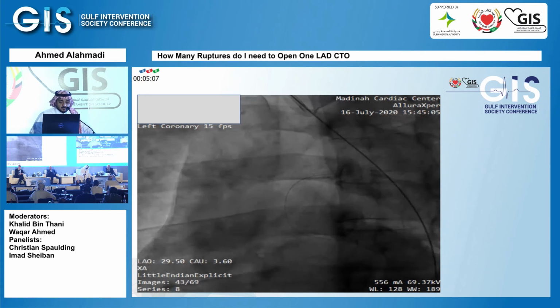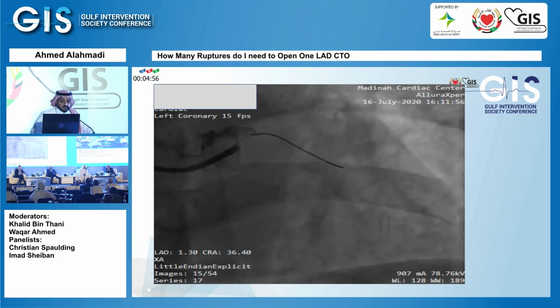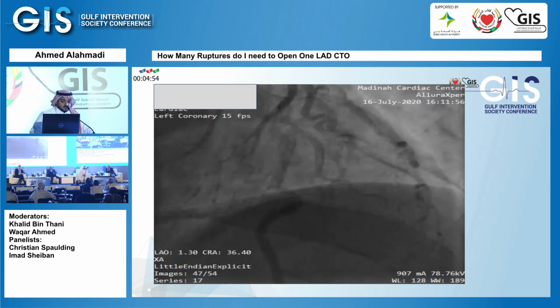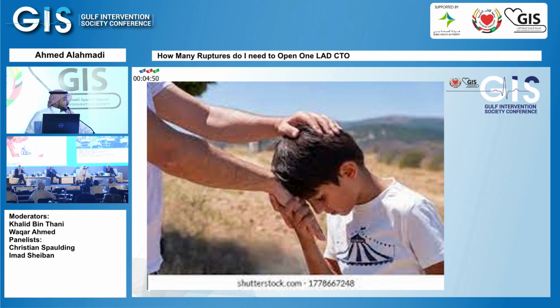After that, we took a picture and did IVUS, and there were no remaining or left behind fragments there. Then we went ahead with wiring and stented the diagonal. So you can name it, who is this? This is my senior. This is me after I finished the case.